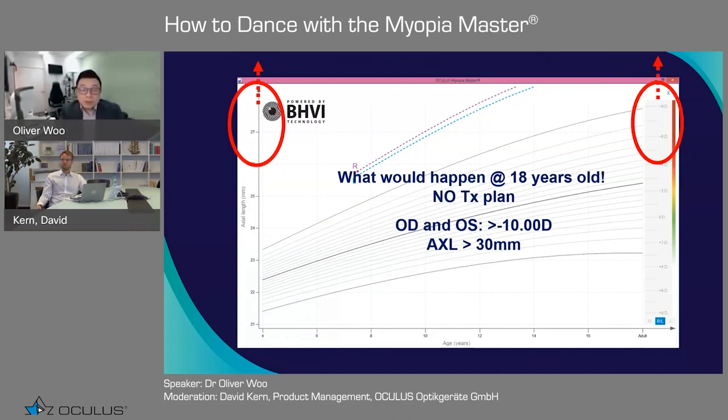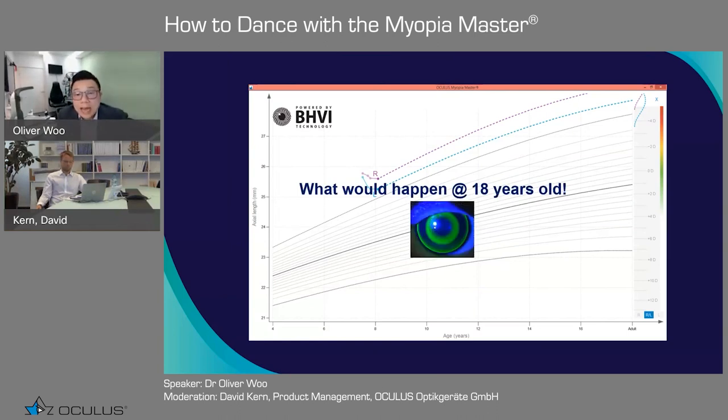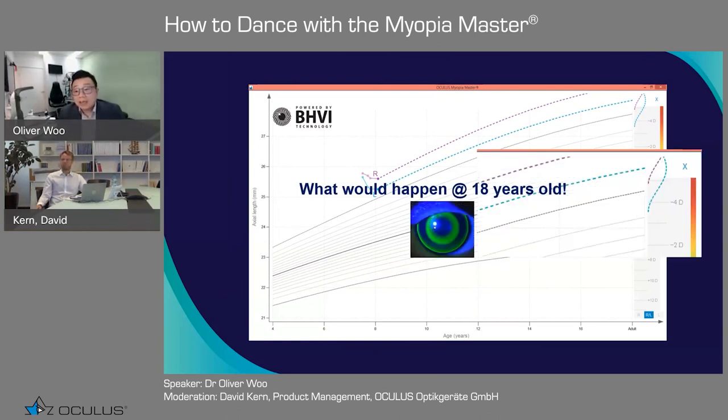This is before any treatment. You can see like a rocket go up. So this is how we see the chart after the ortho-K. We can see in those 4 months, we have already measured the eye size about four times. So that is how we change people's lives, and also how eye size changes.